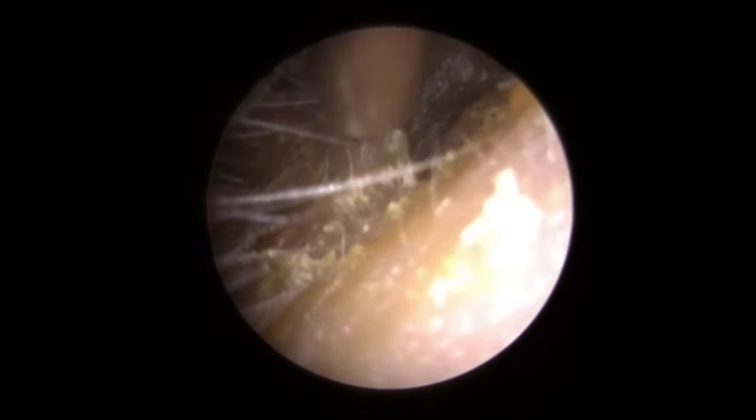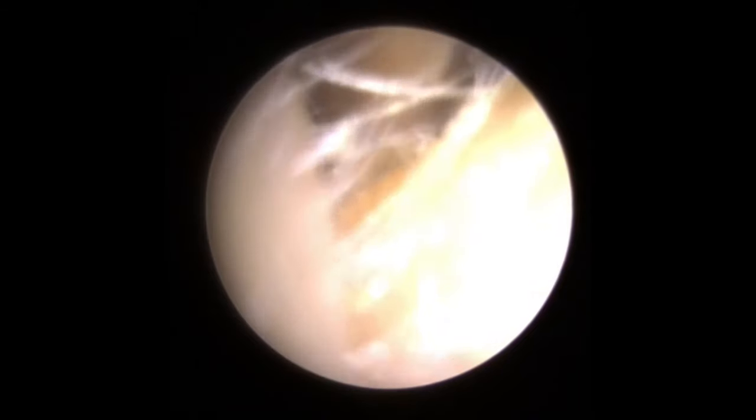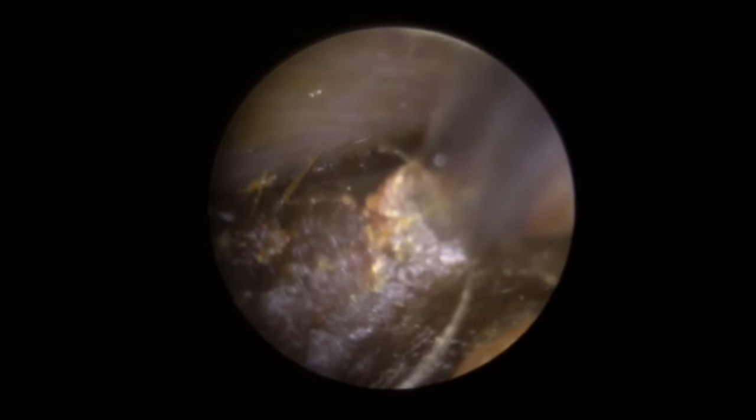What you can see for this first patient is they've got some very, very thick, sticky type wax, mainly at the entrance to the canal here. You can see there's some darker, harder pieces further in as well. I'm just using the micro suction here just to try and release this front section away from the canal wall, because we've got quite a large piece further in.